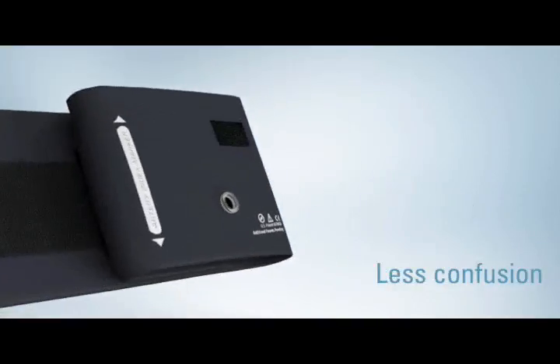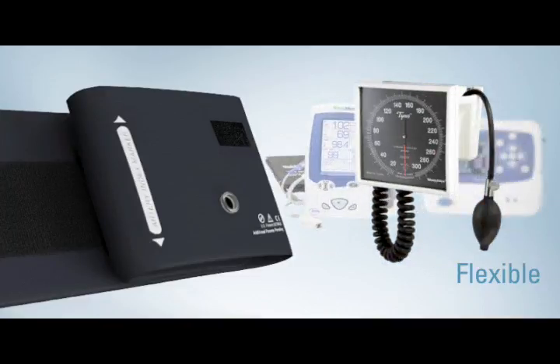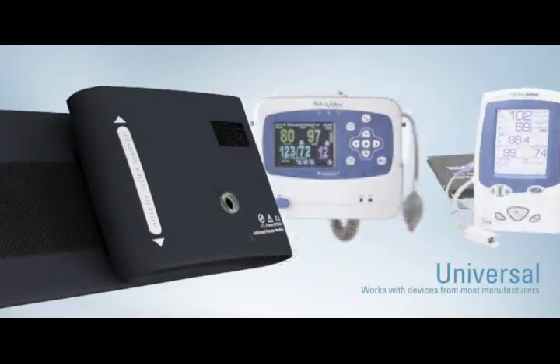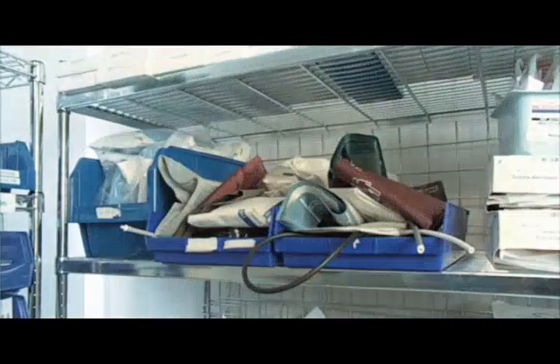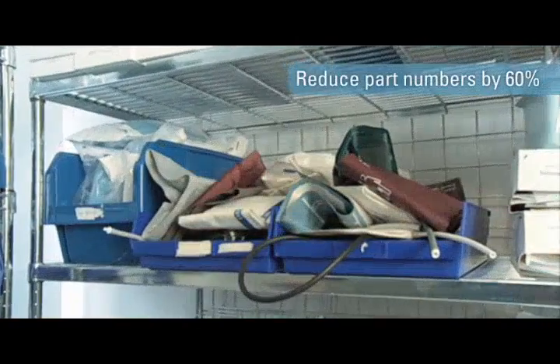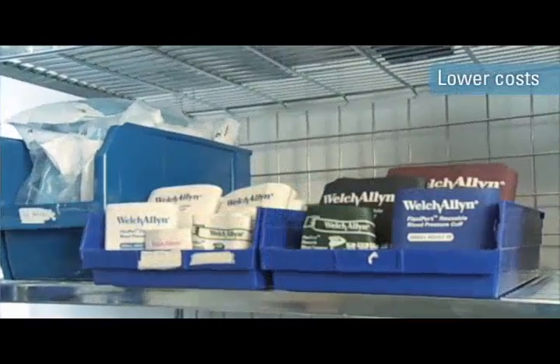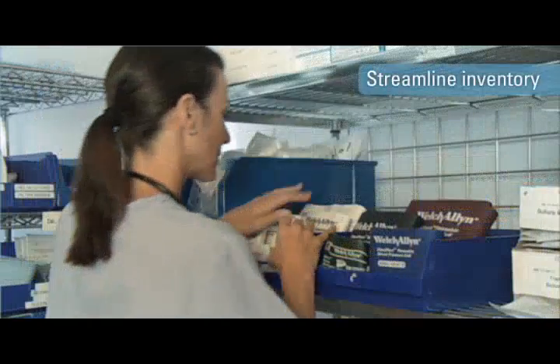FlexiPort cuffs are specifically designed to work on virtually all electronic and manual blood pressure devices, whatever the tubing configuration. FlexiPort cuffs enable you to reduce your cuff part numbers by up to 60%, lowering costs, minimizing inventory levels, and dramatically simplifying inventory management.